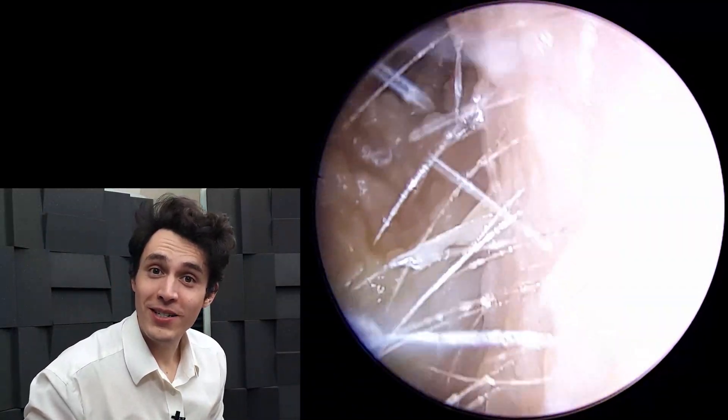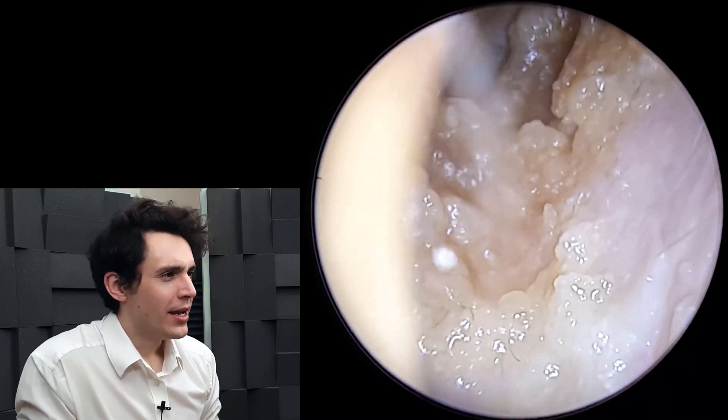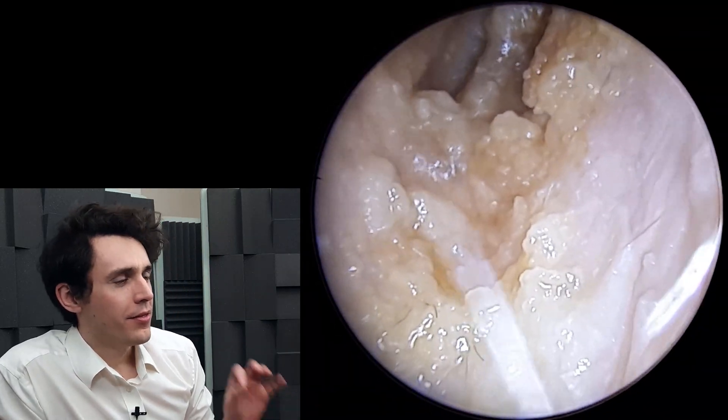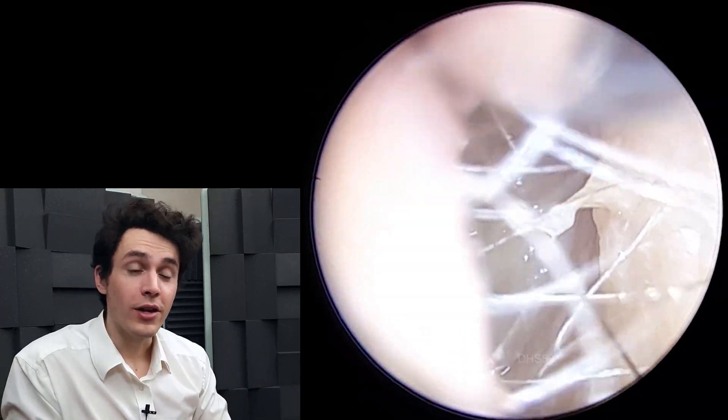Hi everyone, it's Connor here from Durham Hearing Specialists. I hope you're doing well and welcome to another video. We've got quite a nice case here. This is an example of a patient that's treated their ear with hydrogen peroxide.